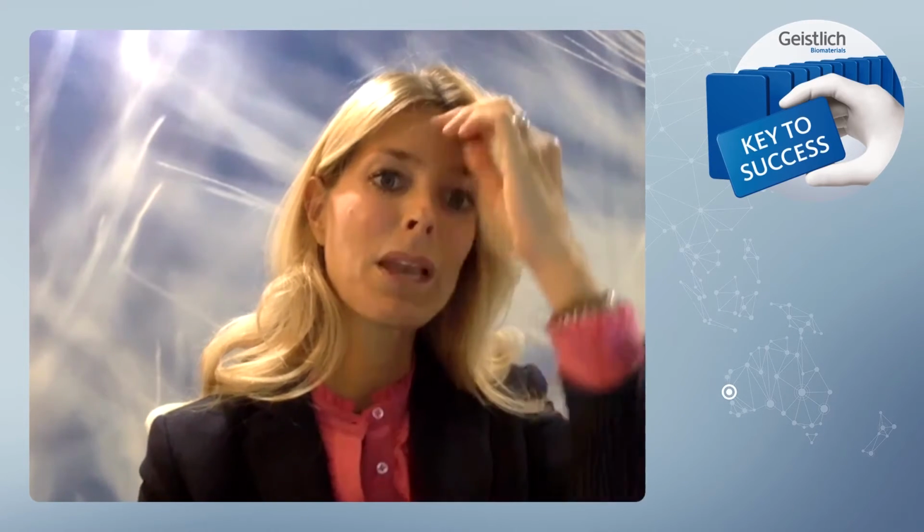So I have a question: when you do the bone augmentation of the lower posterior, where do you place the fixation pin lingually? Do you worry about the lingual nerve? So everything is pre-planned with 2 diagnostic measures. One is obviously the CBCT scan, so you can see exactly where you're going to use the pins. And the second is a 3D reconstruction. I always have the little 3D models that I've shown you in the lecture. And this helps me also with a little aluminium foil to shape the membrane, the titanium reinforced membrane, which I will be putting, and in that position I can decide where the pins can go.